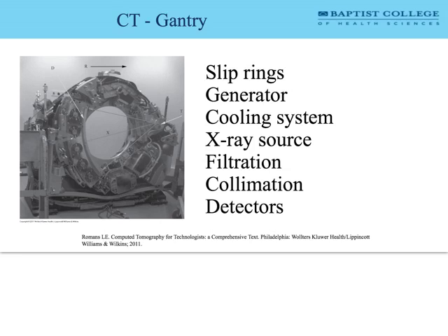So here is the CT scanner, and these are the parts that we are going to be thinking about. We've already talked quite a bit about slip rings. They are cool. They were developed by NASA to allow for the continuous powering of rocket engines even while they're being disengaged, right?